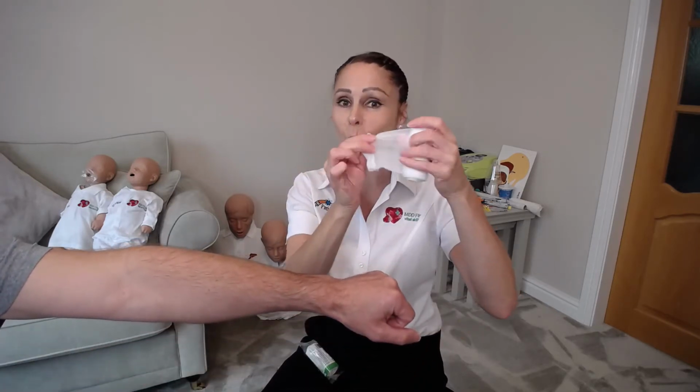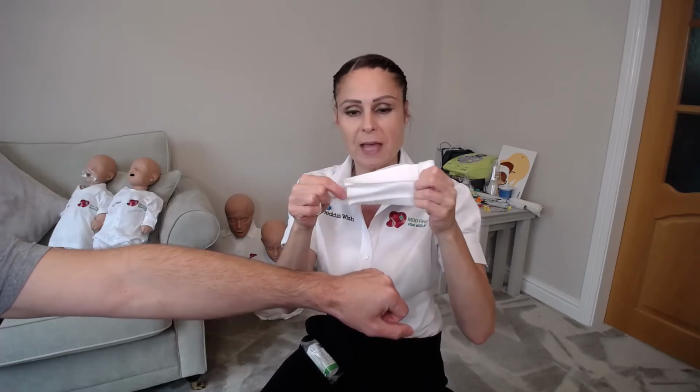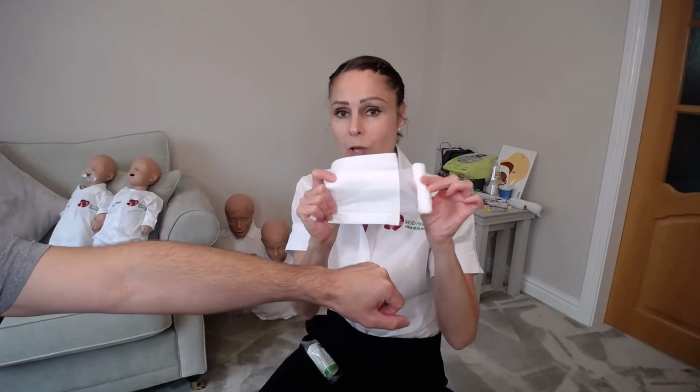So here we have an arm. You first of all unwind the short end of the bandage. It's quite a flimsy, thin bandage, which then leads you to the pad in the middle, which is the dressing area. You can unfold it so it makes the biggest surface area as possible. You then have your longer end. Leave that rolled up, which makes it easier when you're placing the dressing in position. You don't end up juggling with both ends.